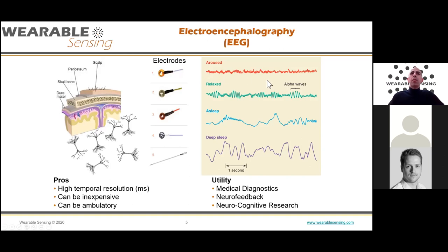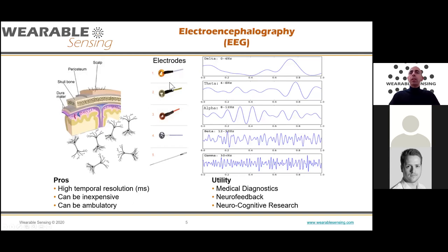On the right you can see EEG traces in different cognitive states. When aroused and alert, EEG looks one way. When relaxed or drowsy, you see spindles — alpha waves. Falling asleep shows different spindles at higher frequency, and deep sleep shows delta wave patterns. To analyze EEG, we look at signals in the Fourier domain, breaking data into power bands: delta (0–4 Hz), theta (4–8 Hz), alpha (8–12 Hz), and so on.